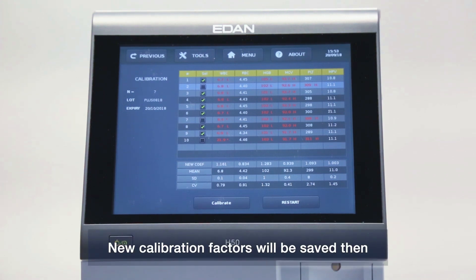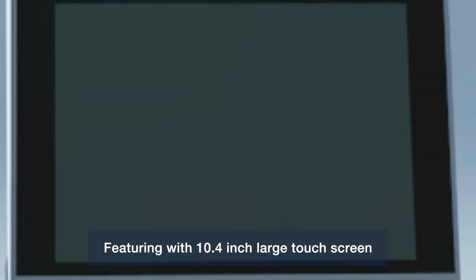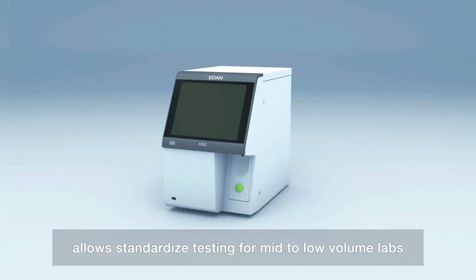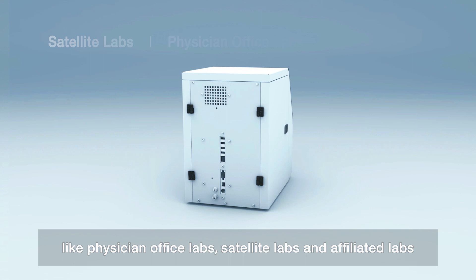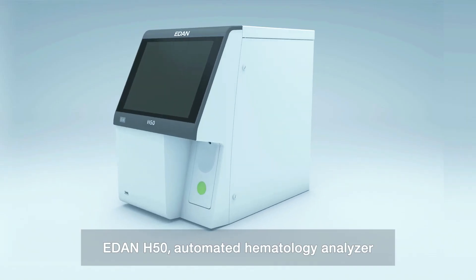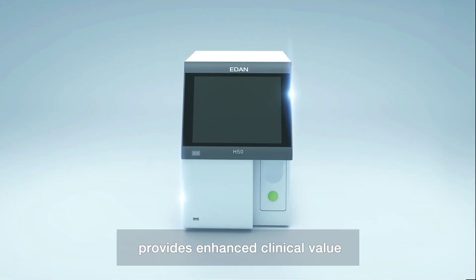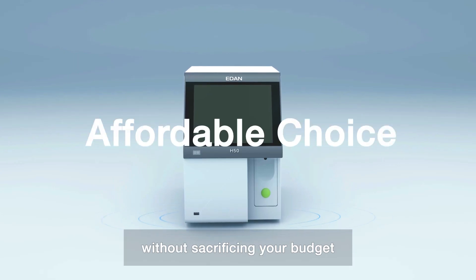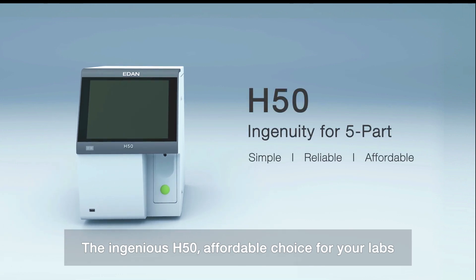Featuring a 10.4-inch large touchscreen with integrated IPU, a 50.6-microliter sample volume allows standardized testing for mid to low volume labs, like physician office labs, satellite labs, and affiliated labs. EDAN H50 automatic hematology analyzer provides enhanced clinical value and improved operational efficiencies without sacrificing your budget. The ingenious H50 — an affordable choice for your lab.